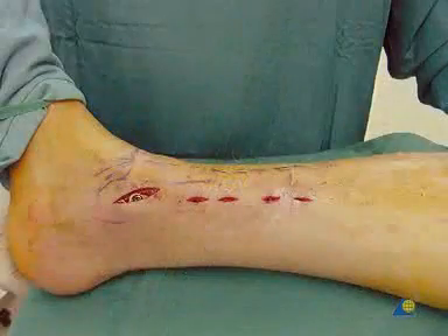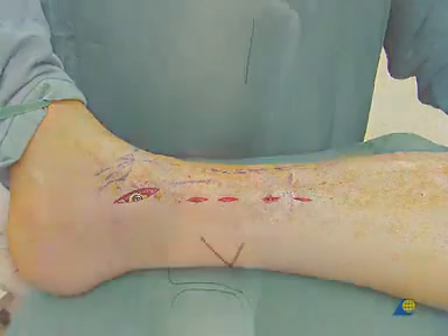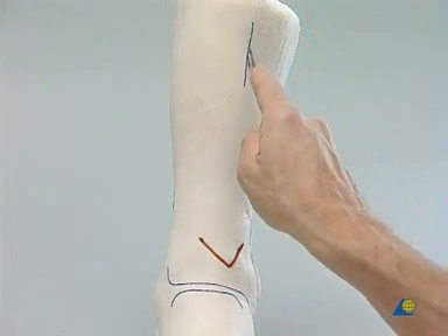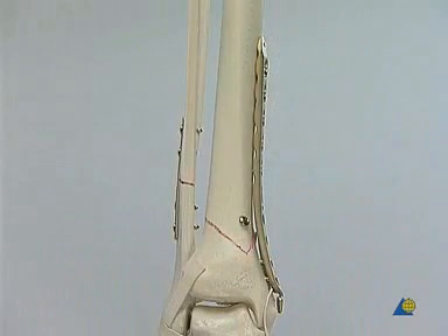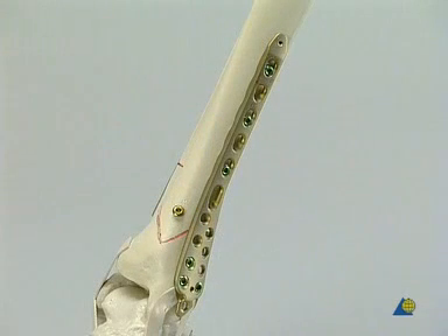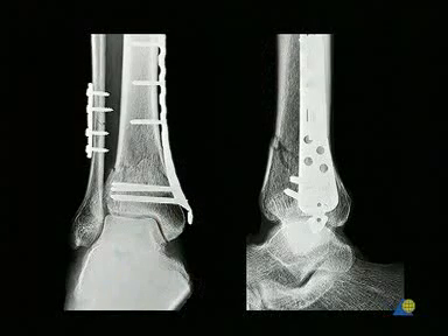This is the clinical situation before skin closure. To see the result under the foam, it is cut open along the tibial crest and the bare bone model is inspected. This simple fracture was anatomically reduced and fixed with a lag screw. The LCP distal tibia plate was applied in this case as a purely internal fixator, thereby protecting the interfragmentary compression screw. These are the post-operative radiographs of a similar case that was fixed without a lag screw.